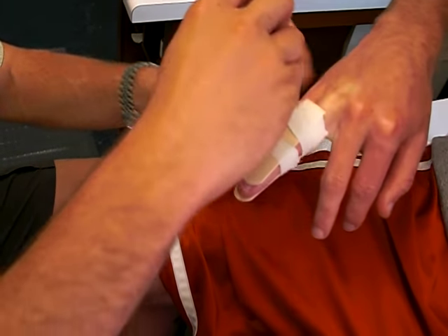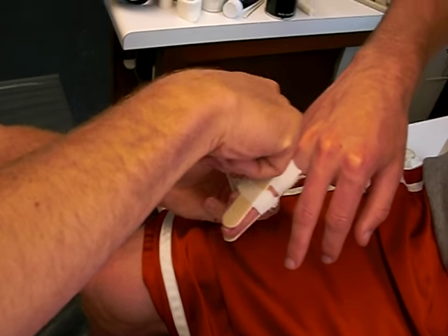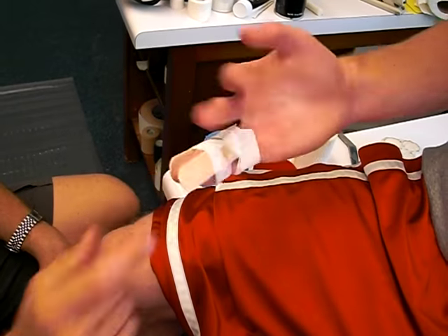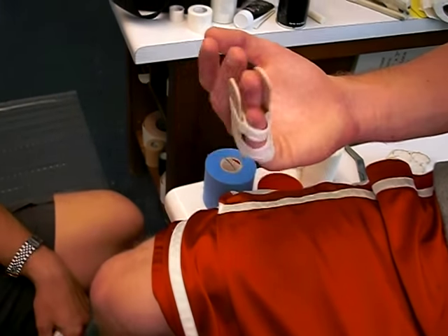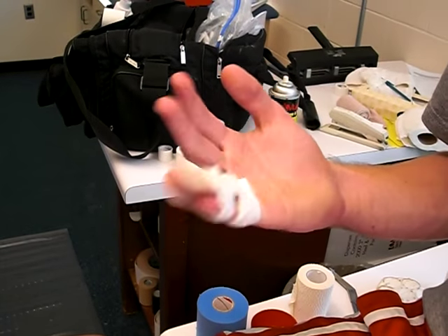Go ahead and continue that right there. You don't always need to put the tongue blade in between — if you just want to do the buddy tape job, you can do just that, and it's going to restrict all motion at all three joints.